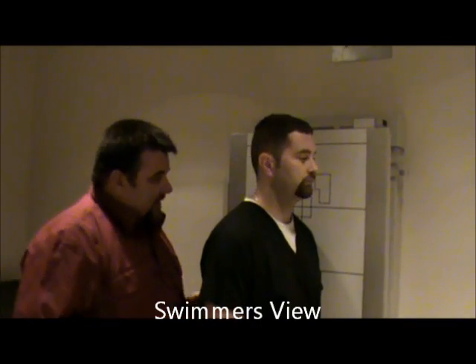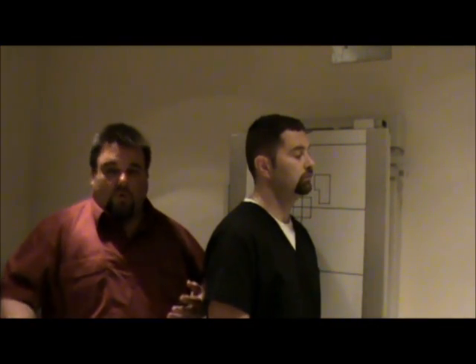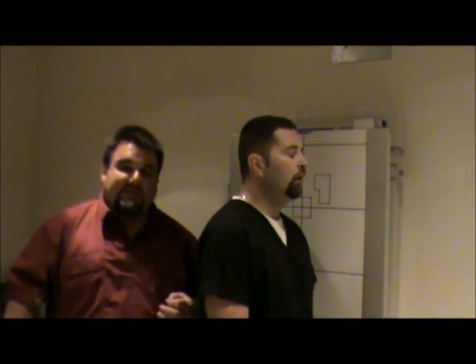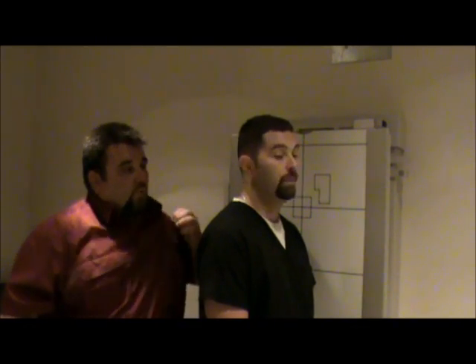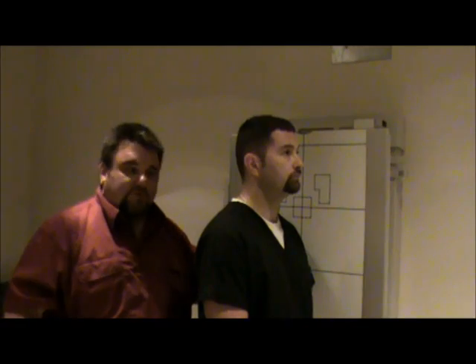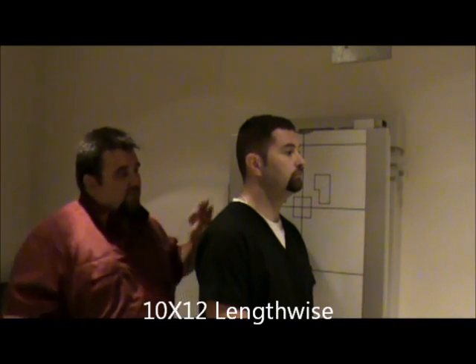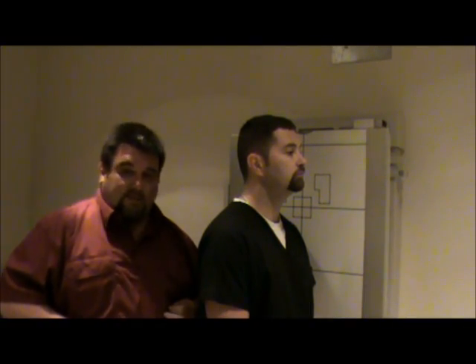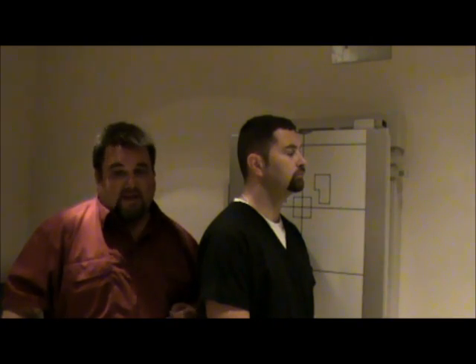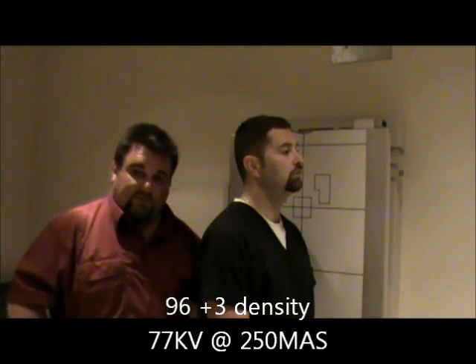Next we're going to do a swimmer's view. The swimmer's view is done when a cervical series has been completed but on the lateral we could only see through C6 — we need to see C7 and the transition into T1. The positioning is similar to a dorsal view; the patient looks like they're swimming. Film size will be 10 by 12 lengthwise. Technical factors: 96 kV plus 3 density, or alternatively 77 kV at 250 mAs. The 96 plus 3 tends to work better.